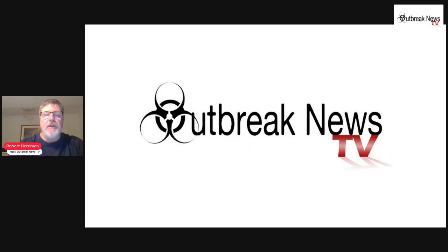Today I'm going to be doing another quiz on parasites, and this will be strictly parasite unknowns. I'll be showing you a photograph, giving you a verbal description, and then I'll let you know what it is and see how many you get right. Part of the correct answer is the correct stage of the parasite. For example, if it's a pathogenic amoeba, is it the cyst stage or is it the trophozoite stage? So that's what I'm looking for. We'll see how it goes.